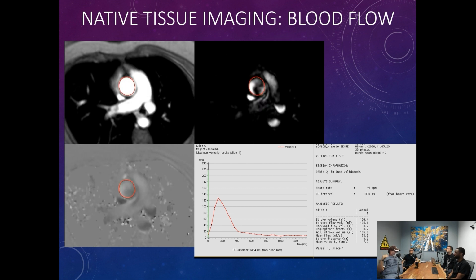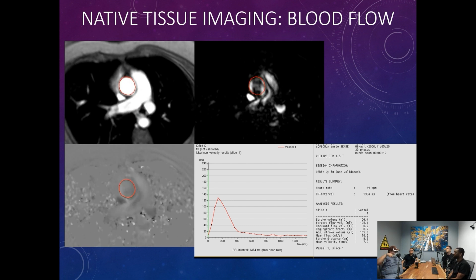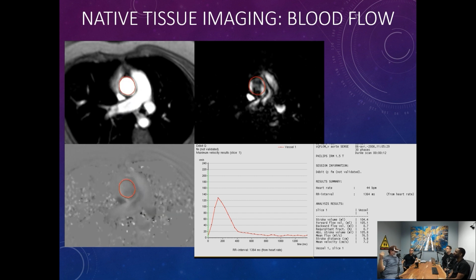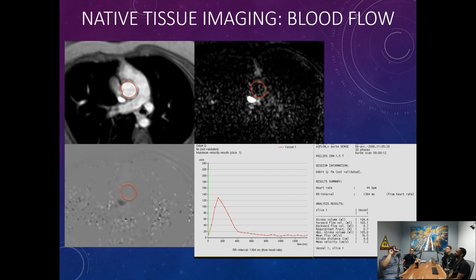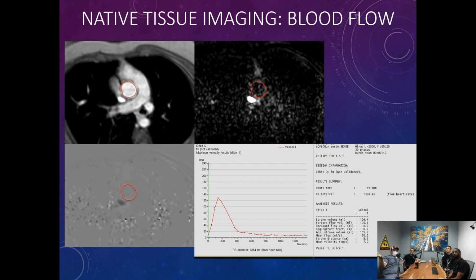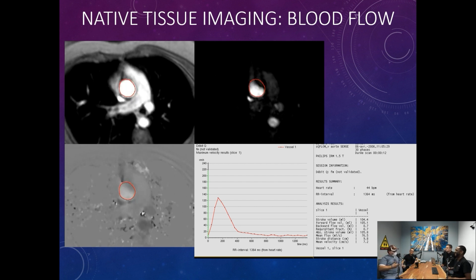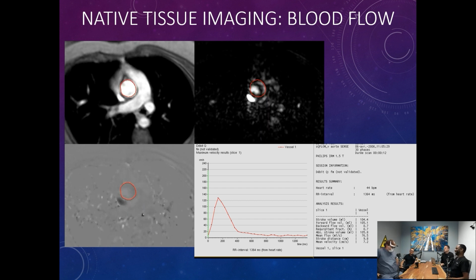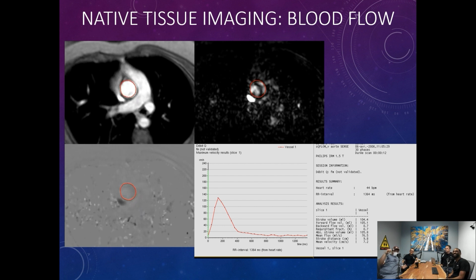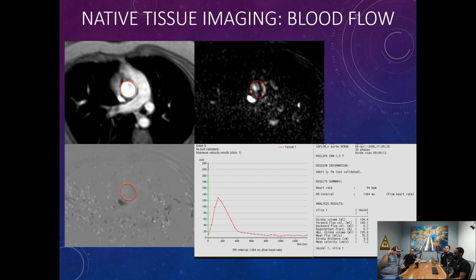Now, the 4D flow, you can imagine every single voxel is a pixel in 3D. On a 2D display, we can show height, front, back, left, right. A voxel is that plus slice thickness. With MR we could really get into space time now. We're talking about, is the universe pixelated? But let's save that for another podcast. There's a smallest unit, this length, width, height, that's the voxel, and we can't get any more precise than that when we're assigning signal.